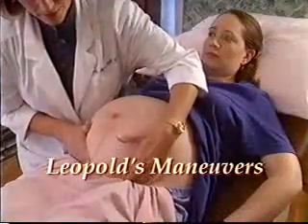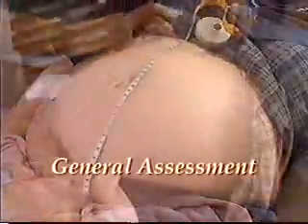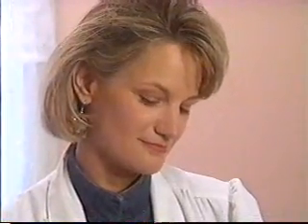After watching this video, the clinician will be able to perform Leopold's maneuvers, assess the fetal status through use of Doppler or fetoscope, perform an accurate measurement of the uterine fundus, and make a general assessment of maternal and fetal well-being within the accepted medical parameters.